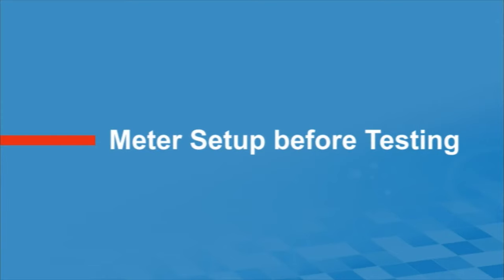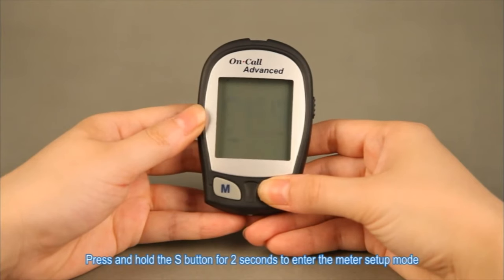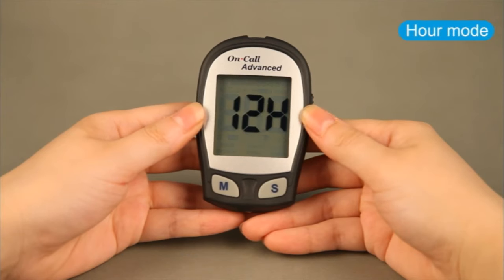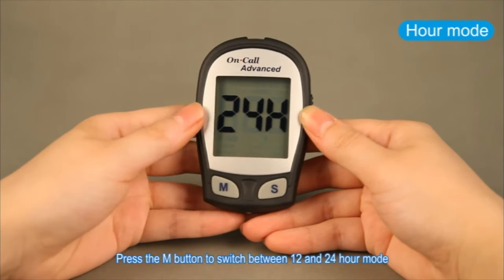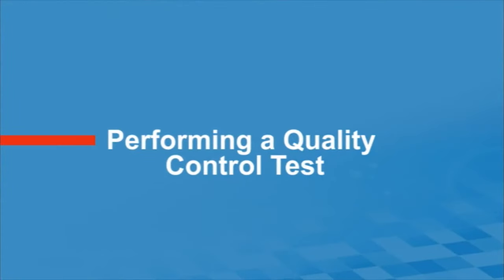The video says: 'Before testing, press and hold the S button for two seconds to enter the meter setup mode. The meter will automatically enter setup mode when turned on for the first time. Press the M button to switch between 12 and 24-hour mode, then press the S button to save your choice.' Okay, mmol — this is just a different machine, I know how to do it, it's just a bit different.